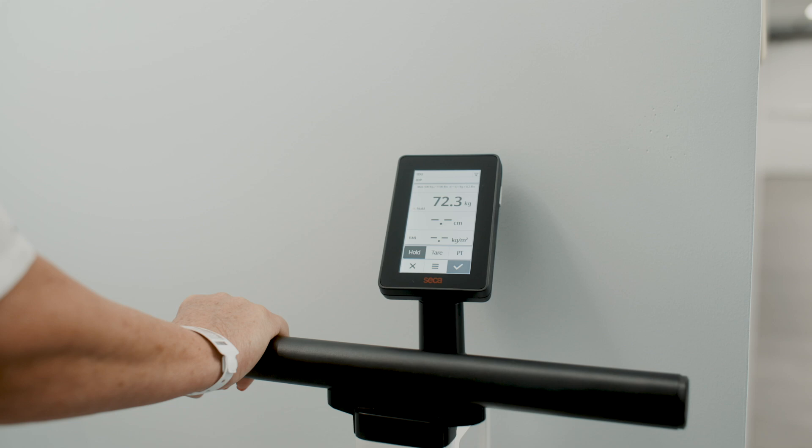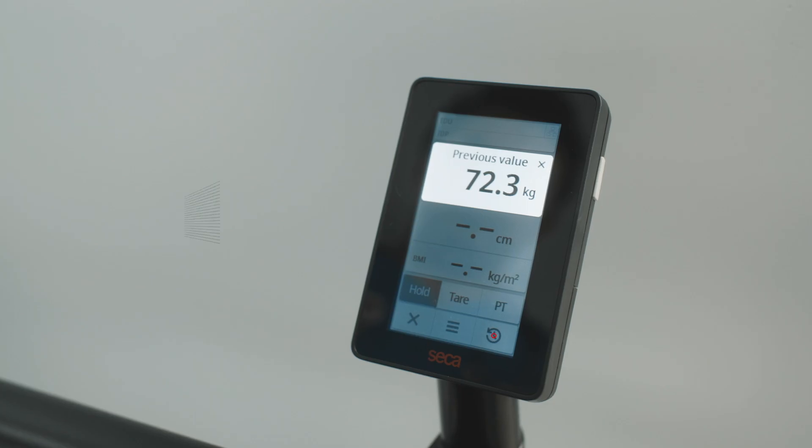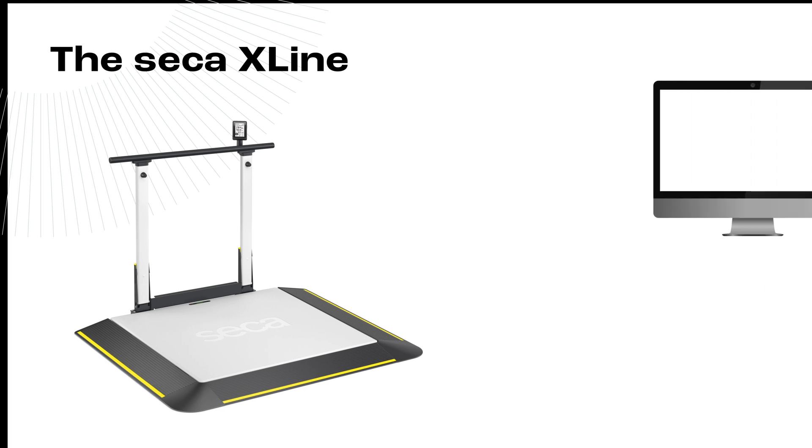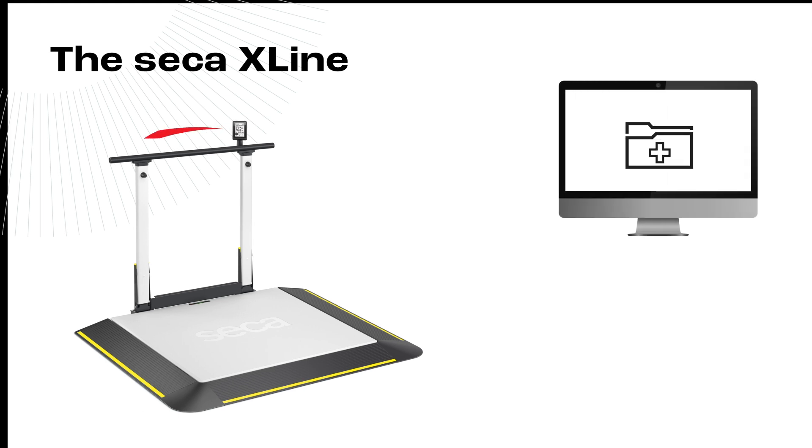A recall function on the device allows you to call up the last measured value even after the patient has stepped off the scale. But to truly safeguard your patient against transcription errors, you can send measurements directly to your EMR system.